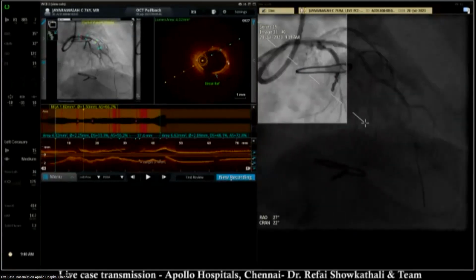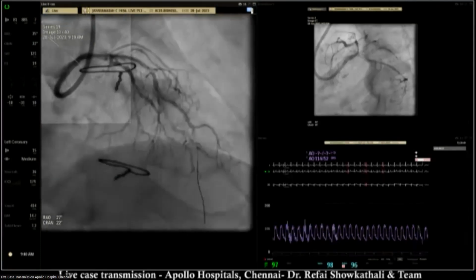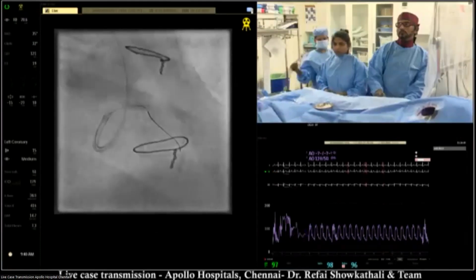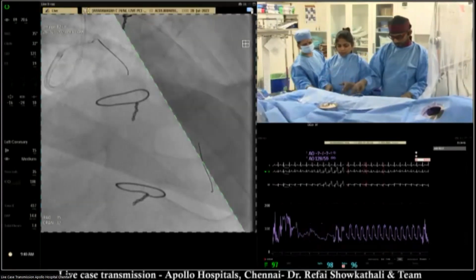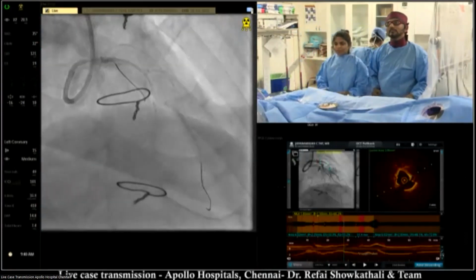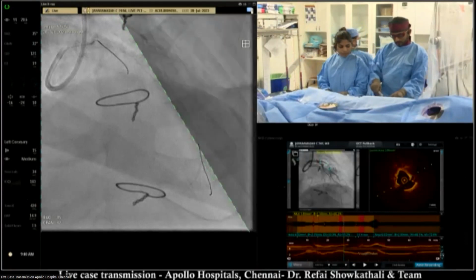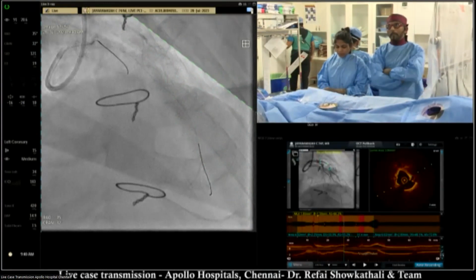Sure. Okay, so Dr. Pathak, would you go with the cutting balloon? Discuss what are the ways to handle a calcified lesion in today's era. We talk about rotablator, rota and rota. Is there an alternative technology for calcified lesions? So I just want to ask Prafulla.